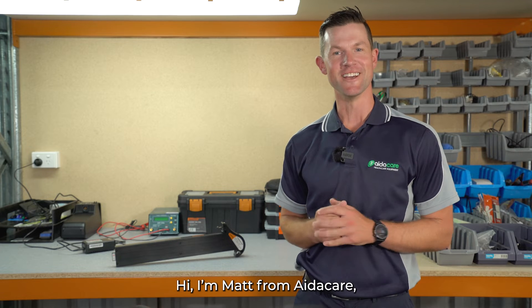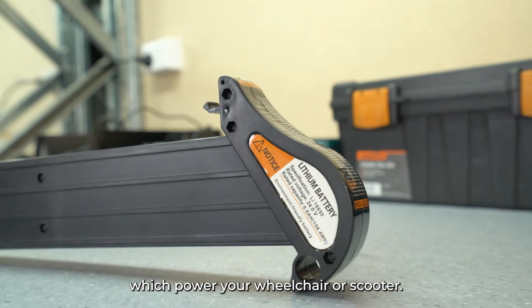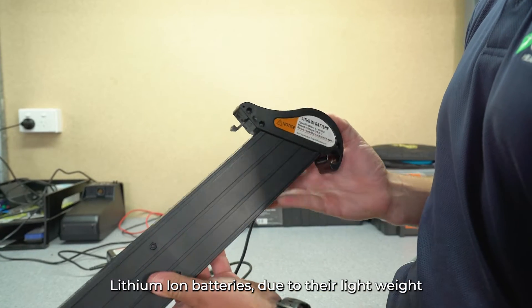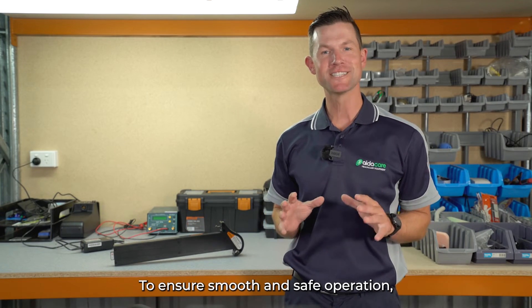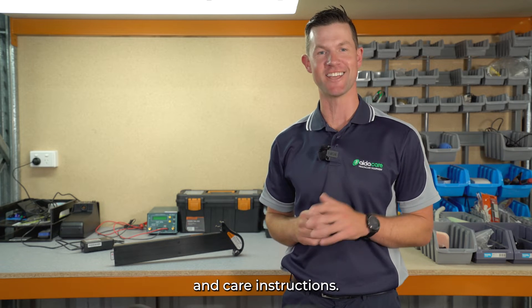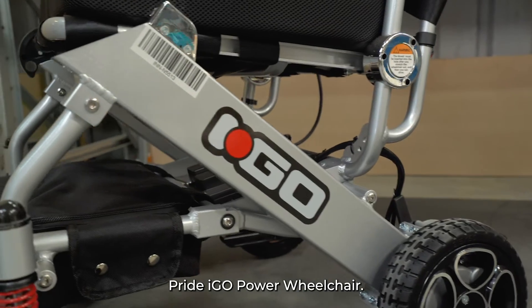Hi, I'm Matt from Aidacare, and today we're going to look at how to properly care for the lithium-ion batteries which power your wheelchair or scooter. Travel wheelchairs and scooters are powered by lithium-ion batteries due to their lightweight and great power output. To ensure a smooth and safe operation, it's crucial to follow the proper charging and care instructions. Today, we will be demonstrating proper care and maintenance with the Pride iGo Power Wheelchair.